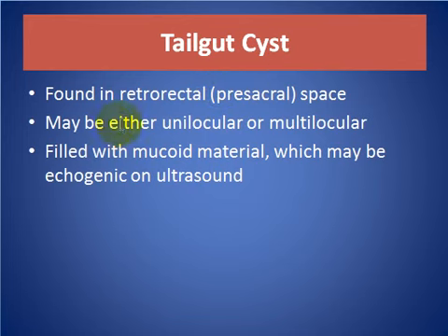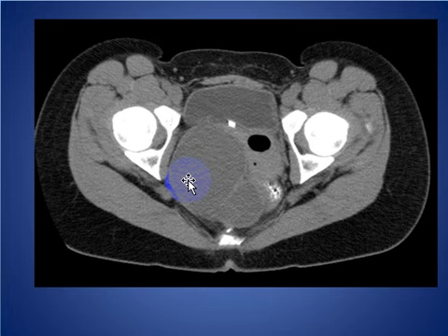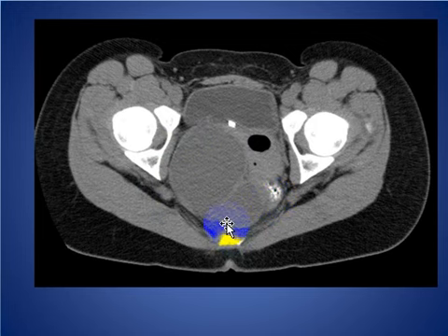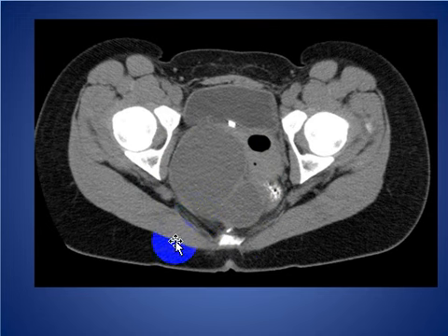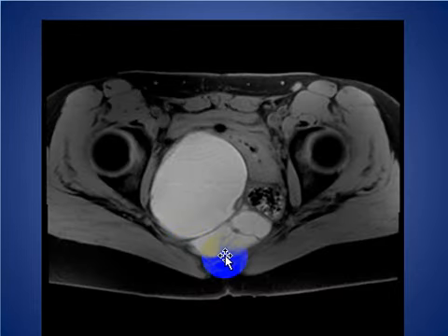Tailgut cyst: found in the retrorectal or presacral space, may be either unilocular or multilocular. It is a cystic mass lesion filled with mucoid material, which may be echogenic on ultrasound. Here we see a multilocular cystic mass lesion in the sacral region pushing the rectum and bladder; the differential includes duplication cyst but the operative finding was tailgut cyst. MRI of the same patient confirms a non-enhancing cystic mass with multiple septations.